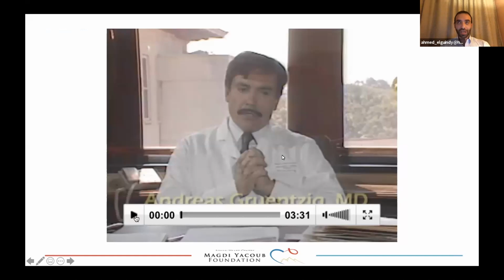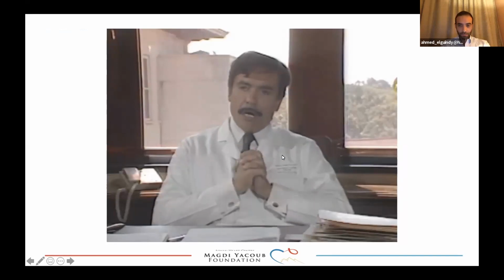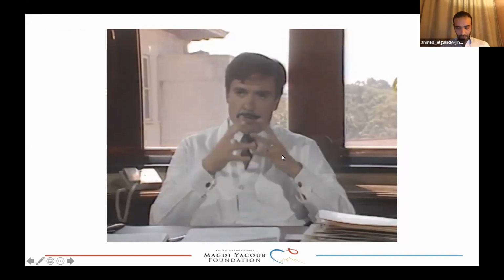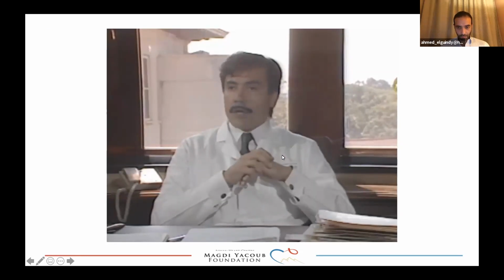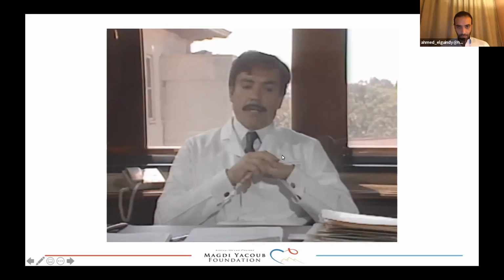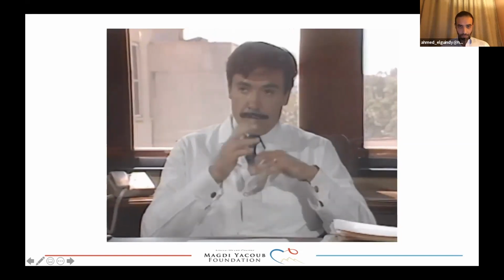Like to depart on more total closures and try to learn how to deal with total closures, how to approach total closures, and to learn how to technically recanalize total closures. As you know, in peripheral dilatation, we do this all alone. Charles Dotter did it in 1965 or 4, that he crossed the total closed iliac artery with a guide wire and pushed his coaxial catheter through, as he did it also in the SFA. Therefore, to cross total closures is not a new experience for me. I've known this since 15 years now myself.